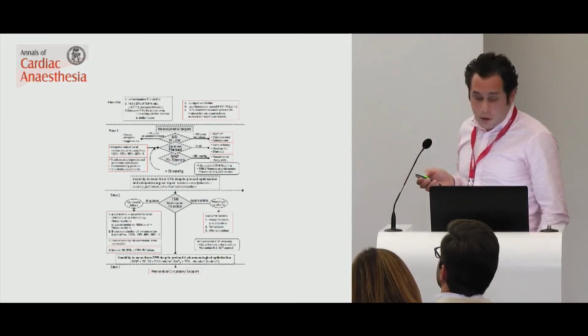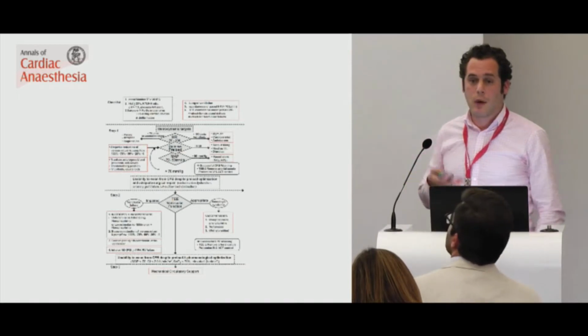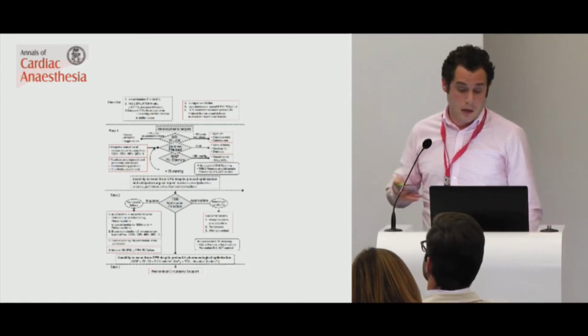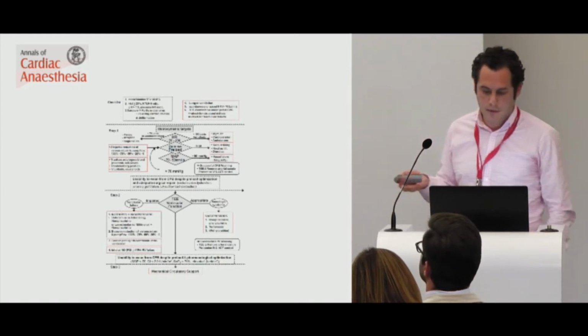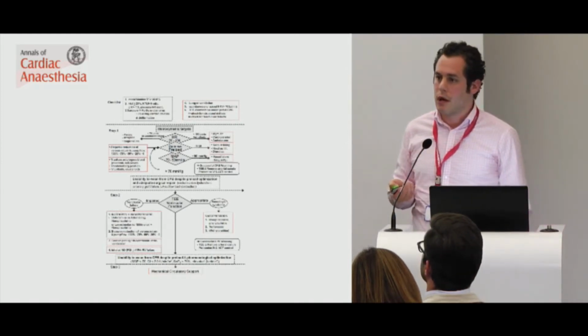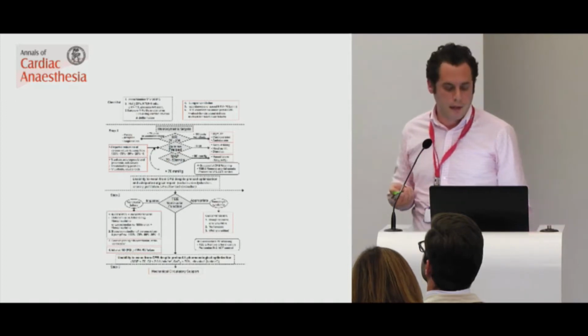Pacing as well, there should be clear communication with the surgeon that the pacing wires are working and checking the threshold. And there may be a rate that you've decided to come off bypass at. Most surgeons would like 70 to 80. It may be that if you've got some right heart dysfunction, you may want to pace the heart faster.